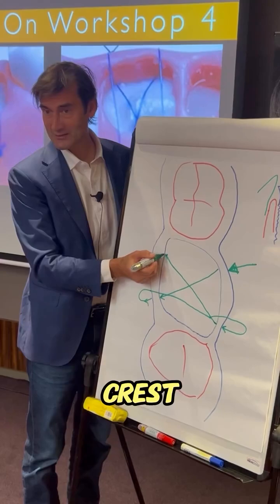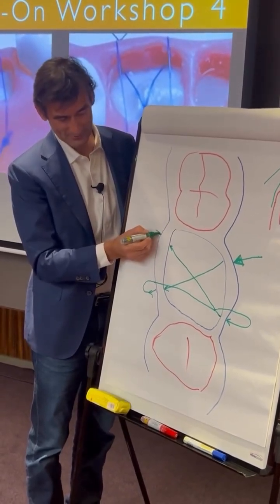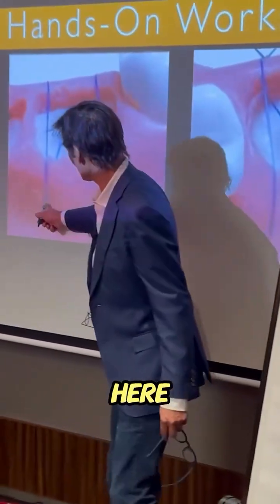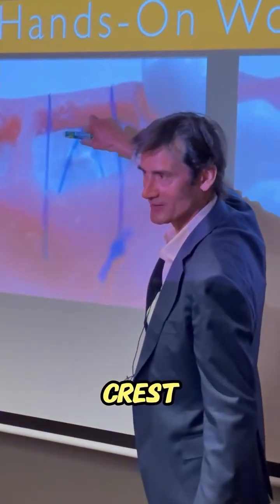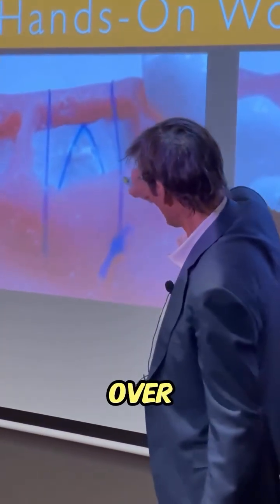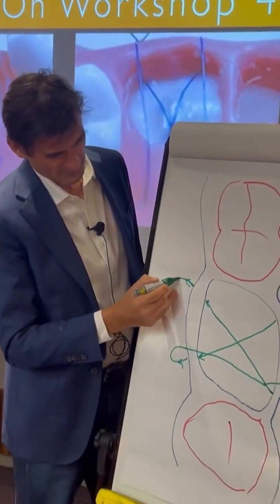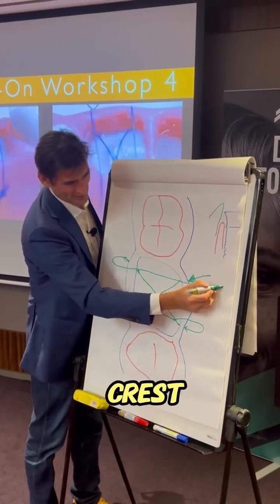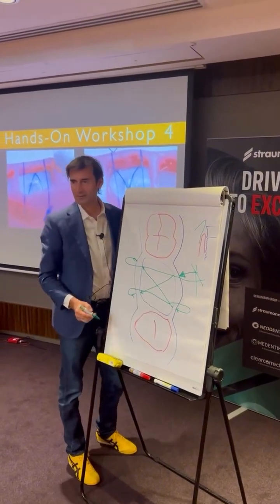Then grab the bottom of the gingival crest — on top of the membrane — and come out here. You cross, come on, and go again over the gingival crest. Go over the gingival crest, over this, and then tie off here. You come back, go over the gingival crest, go over the gingival crest, and tie these two.